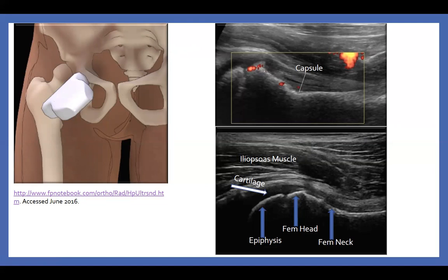When there's fluid inside, it tends to distend it. And this is actually a general rule. Whenever you have a space, it's exactly the same situation as the vagina. You see an echogenic central line because it's a hollow space, and when these layers collapse on each other, you form the echogenic line. That's a general rule, so keep that in mind, because whenever you have fluid in this space, it starts to distend it, and again, effusion starts to form. That's just some repetition for you.